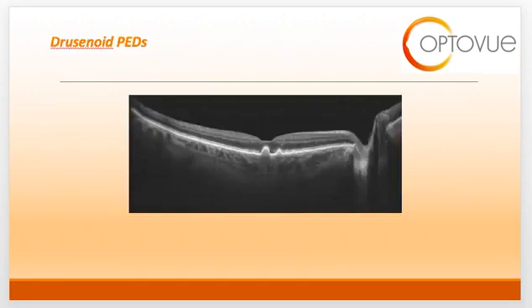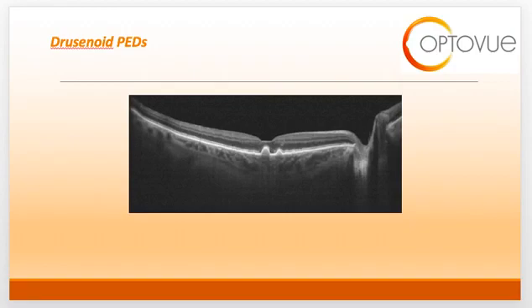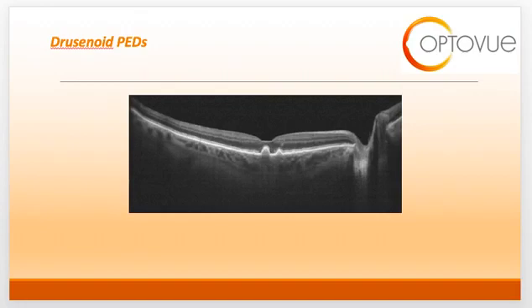The second type of PED is a drusenoid PED. Drusen reside at the Bruch's-RPE complex, so a drusenoid PED results from drusen pushing anteriorly on the RPE. Drusenoid PEDs appear as well-circumscribed elevations of the RPE that are usually turbid or hazy white in color. They may have irregular or well-defined borders. Note the hazy color underneath the RPE, which distinguishes this from a serous PED. Use the location, size, and internal reflectivity to help classify the PED.